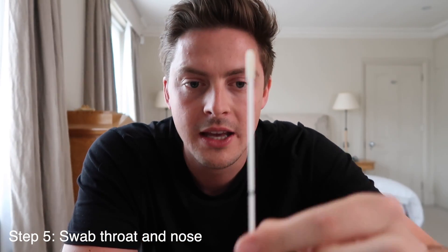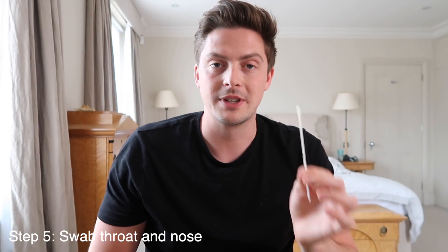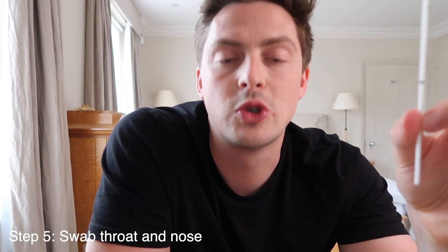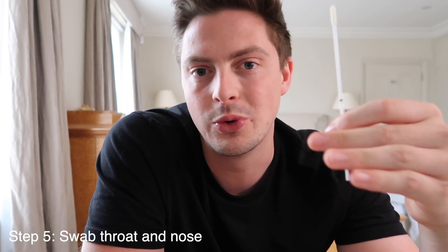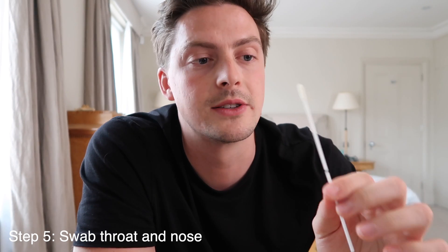Now I'm going to put the swab into each nostril. You insert it at an angle, about two to two and a half centimeters in, until you feel a little bit of resistance — don't force it; you don't want to cause bleeding. Leave it in each nostril for about 10 to 15 seconds.